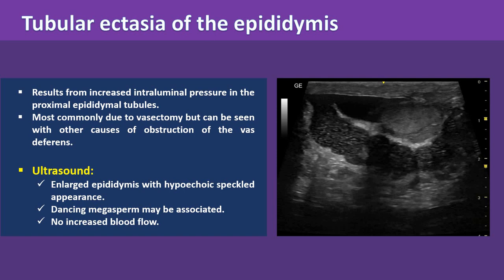Tubular ectasia of the epididymis results from increased intraluminal pressure in the proximal epididymal tubules, most commonly due to vasectomy, but can be seen with other causes of obstruction of the vas deferens. On ultrasound, the epididymis is enlarged with a hypoechoic speckled appearance. This appearance results from linear hypoechoic structures with echogenic walls within the enlarged epididymis. Dancing megasperm may be associated.